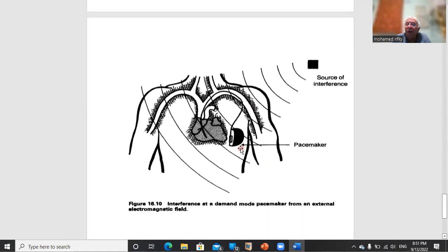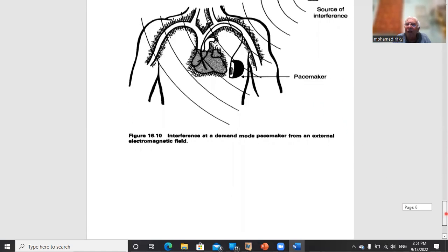And this is the pacemaker. This is the long-term type where we make an open heart surgery, where we implant the battery, and the electrodes are embedded in the endocardium, whether atrium or ventricle. Of course, it also senses the capability of the ventricles or the atrium to contract, and it stops and gives the heart a chance to contract. So they are affected, of course, as we said before, by electromagnetic equipment such as diathermy and electrical.